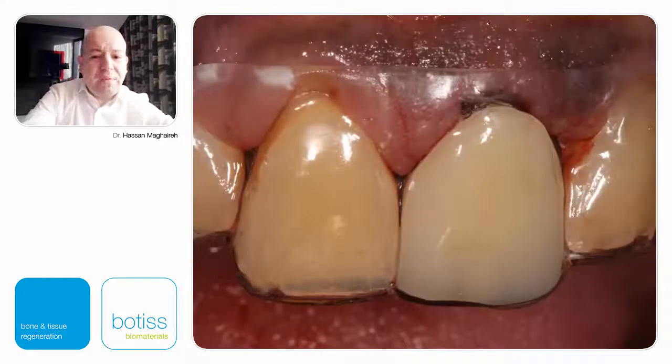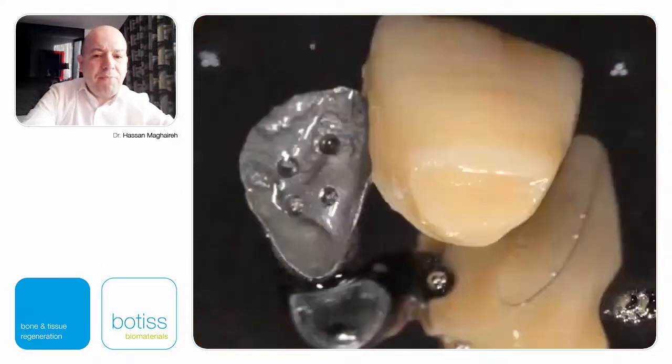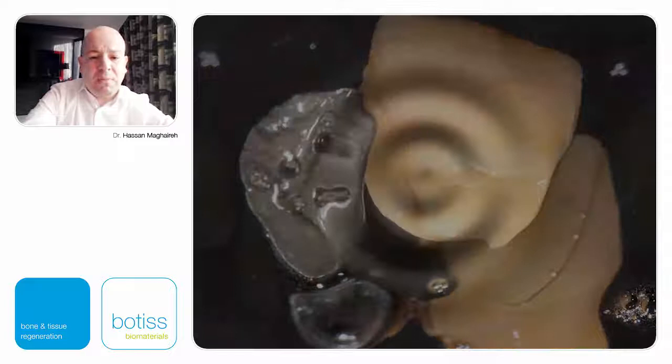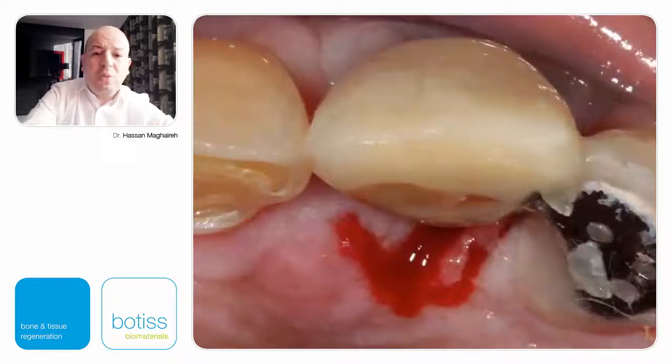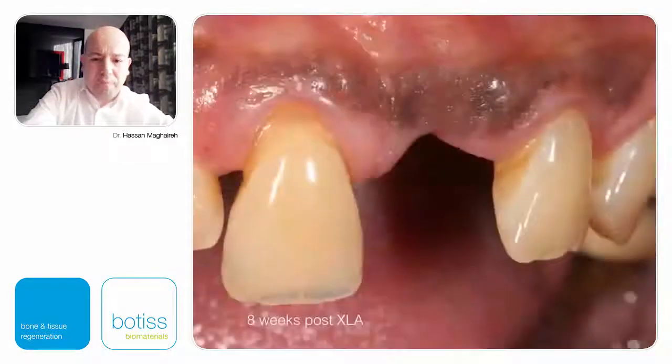And from there, we use an Essex retainer as a temporary backup, but I usually like to use my Rochettes. I always try to aim for a fixed temporary, because with a fixed temporary you get the best soft tissue maturation, rather than a denture whenever you can. But we know these fixed temporaries are cemented using adhesive cement, so they tend to come out. That's why we like to have this Essex retainer as a backup.